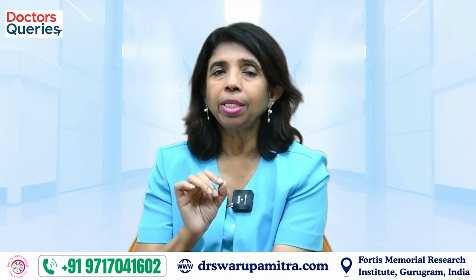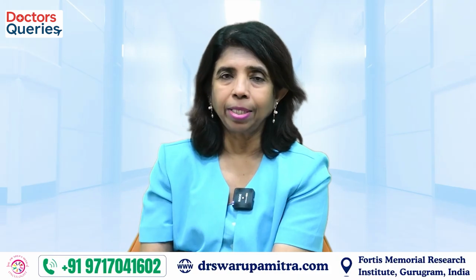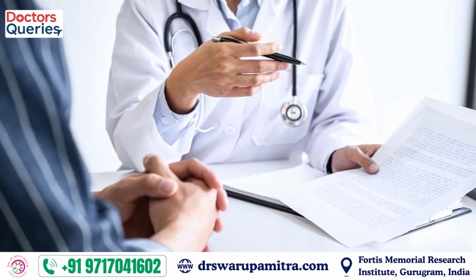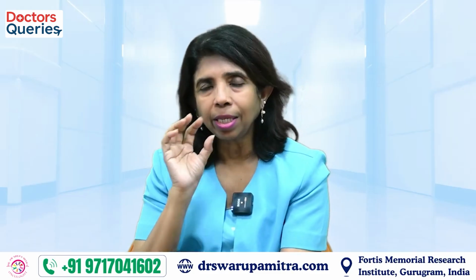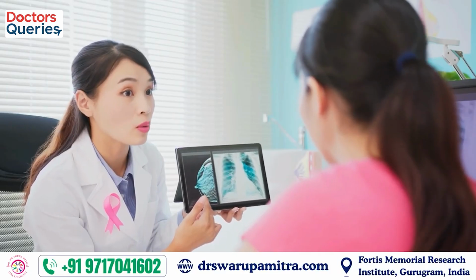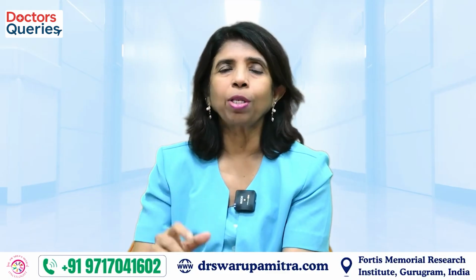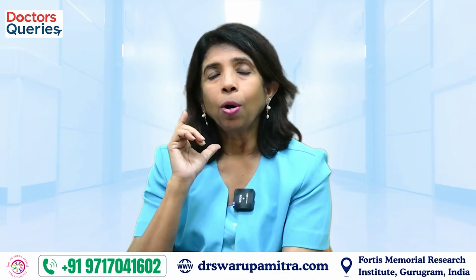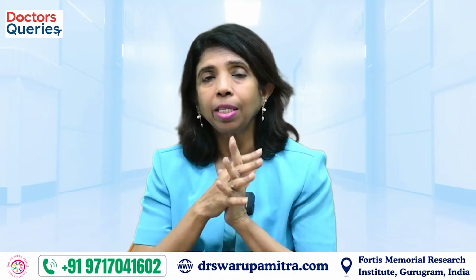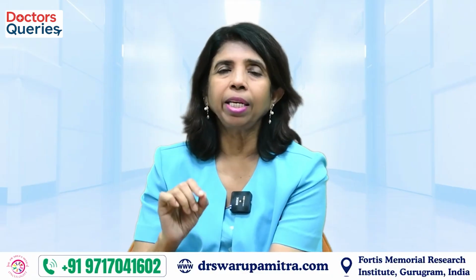So when a patient comes for radiation treatment, it is done in steps. The first step is counseling the patient. We sit with the patient, read all the papers which the patient has, understand the disease of the patient, understand the biology of the tumor, understand all the scans, the MRI, the PET scans, the CT scans, and also the histopathology of the patient. And we need to also examine the patient well. And once the patient has been studied well and the disease has been understood well, the radiation planning begins.